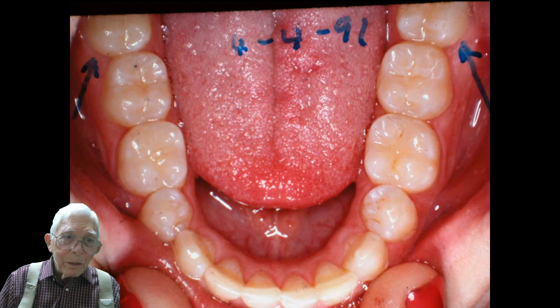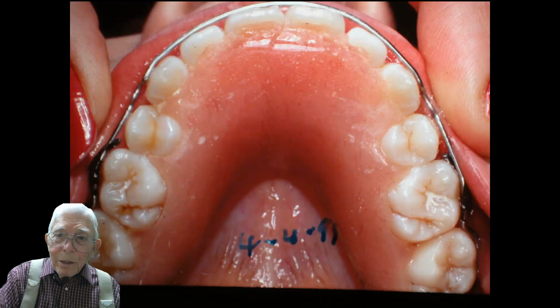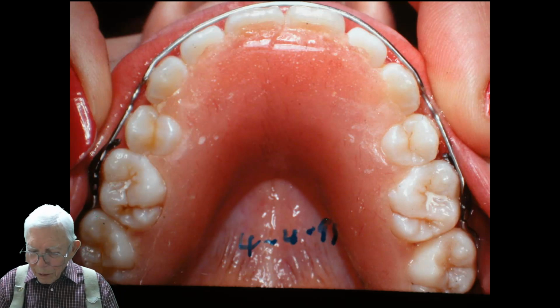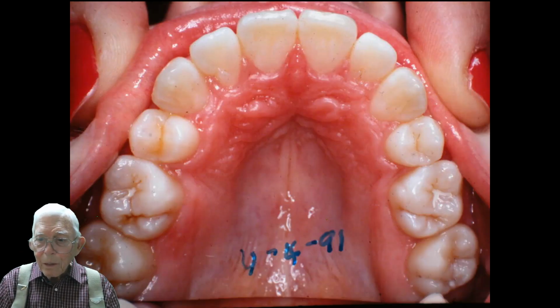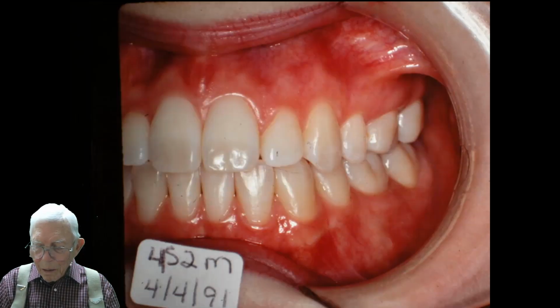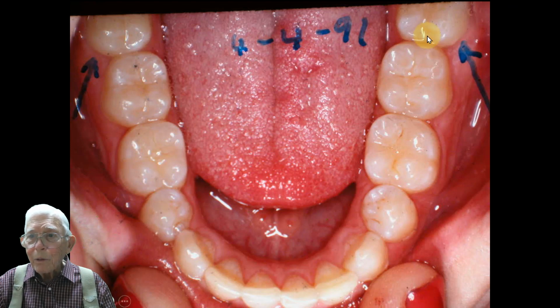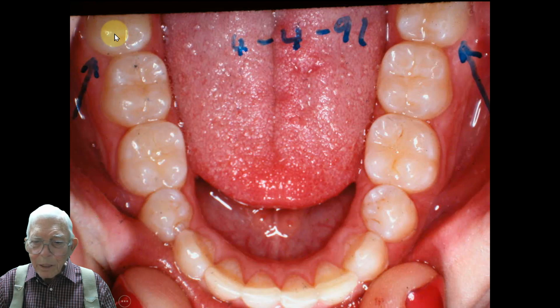So I was mistaken on the wisdom teeth. We took this bicuspid out, and the wisdom tooth came in, and you can see it on the case here. You can see it up the top there. The wisdom tooth is in there in place, and that's the wisdom tooth. So we did keep the wisdom tooth, and we lost the second bicuspids, but we were able to get room.